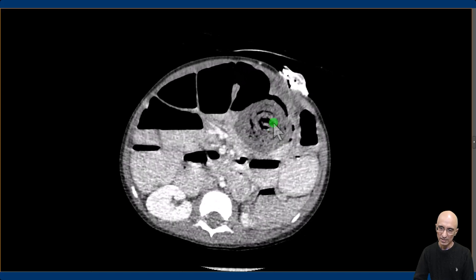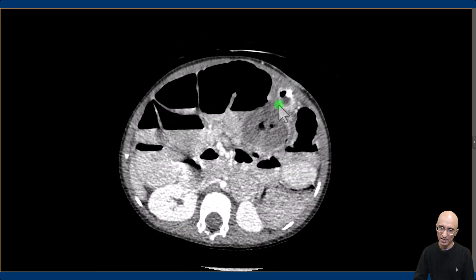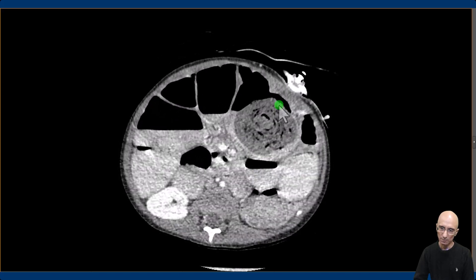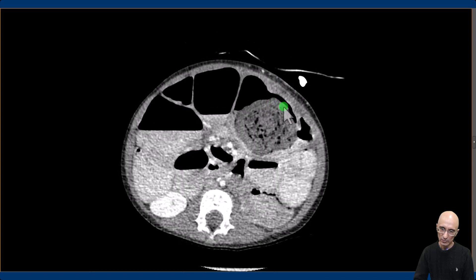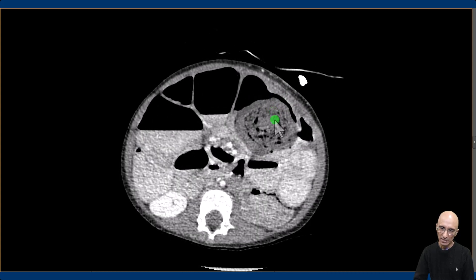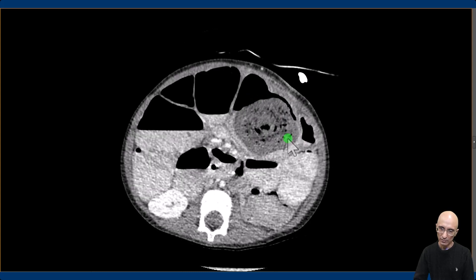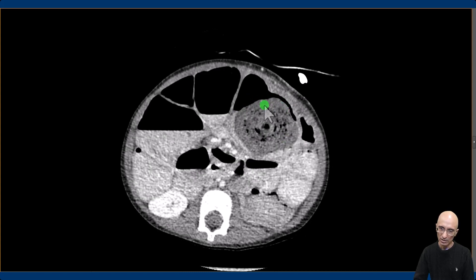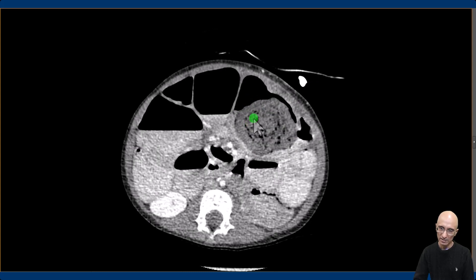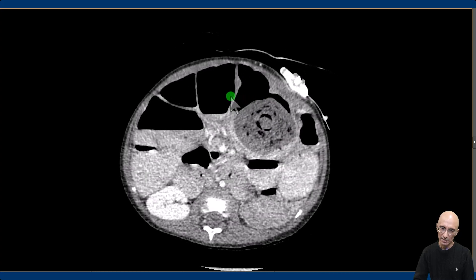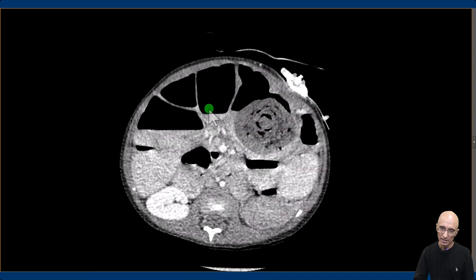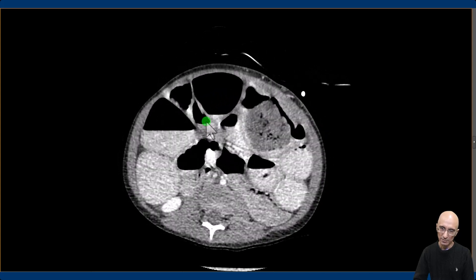On the CT examination, we can see the percutaneous gastrostomy tube. In the bowel loops below the gastrostomy tube, we can see endoluminal particulate material which contains multiple bubbles of gas in concentric circles. Upstream to this particulate mass, there is dilatation of the bowel loops consistent with bowel obstruction.